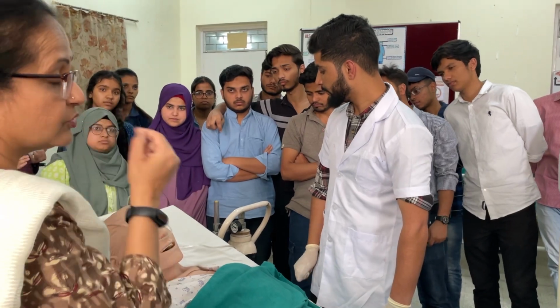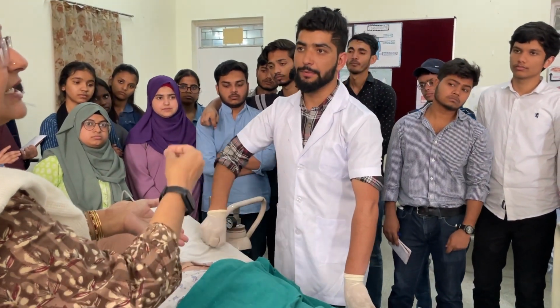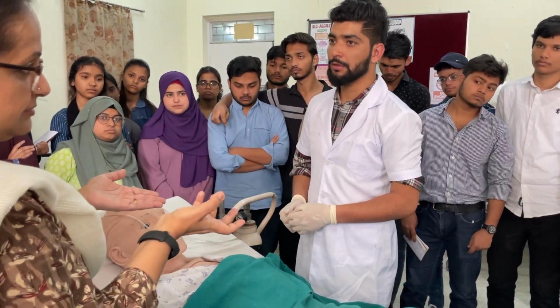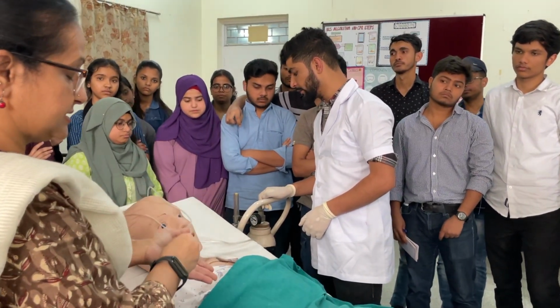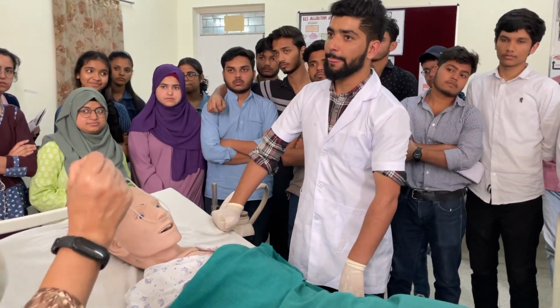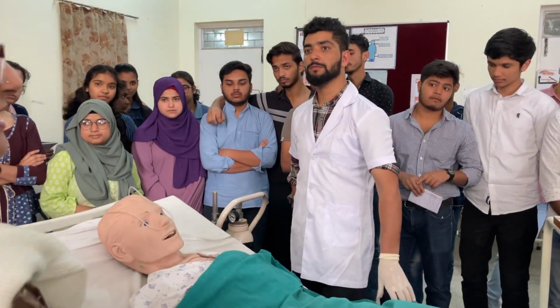Before putting into the nostril, you have to check on the hand or in the water whether the oxygen is coming. Everything has to be checked, and then only you put it. You should know all these things, because in hospitals nowadays, what type of oxygen cylinders have you seen?